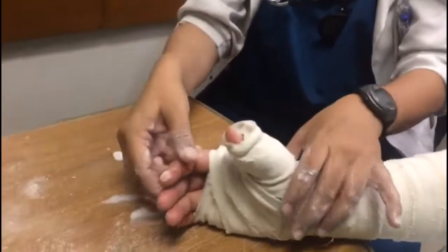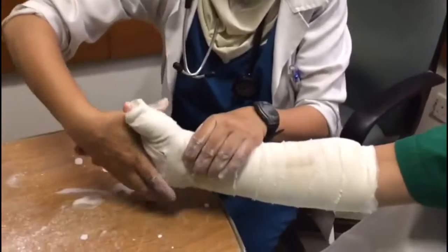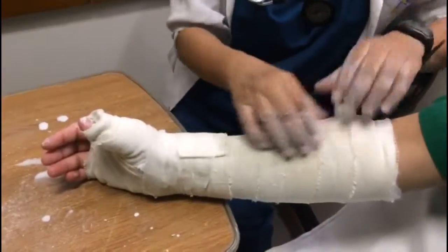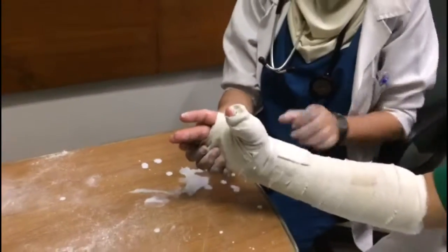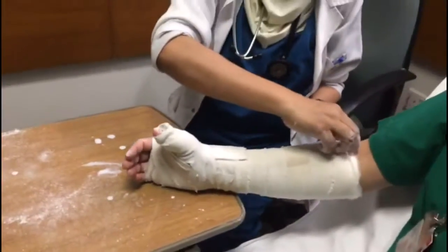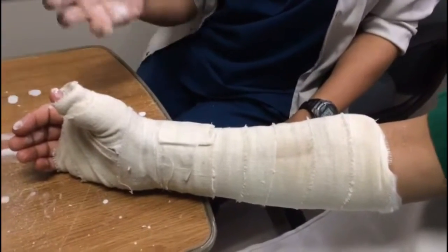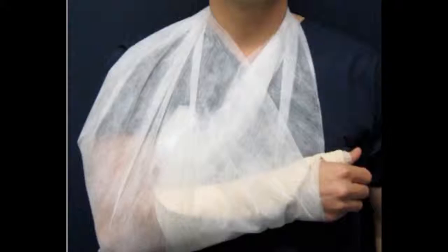The wrist should be in slight extension, approximately 20 degrees, with the thumb in functional position. Ask your patient to envision holding a soda can. Maintain positioning until the splint material hardens. Then reassess distal pulse, motor and sensation, and secure the splint to the forearm.